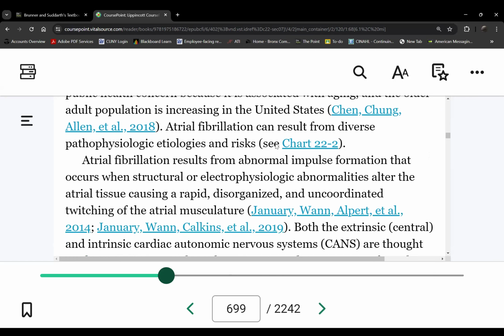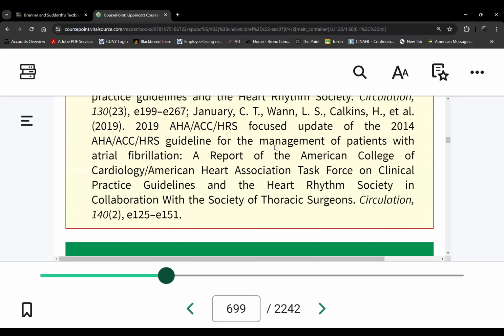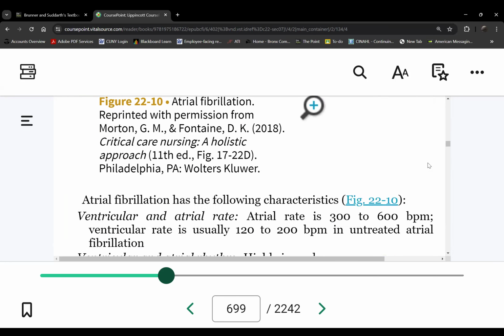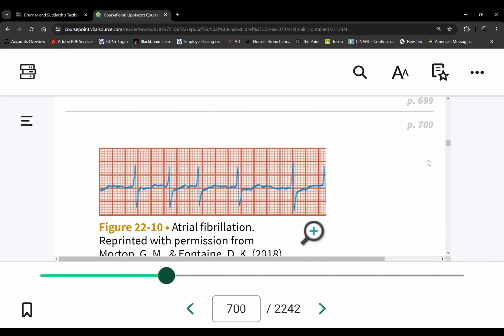So first question, let's answer the 5 again. So let's start with, what does it look like? That's one type of AFib. Should be a second picture. No, you only have one picture. So only one strip. Okay, that's AFib.